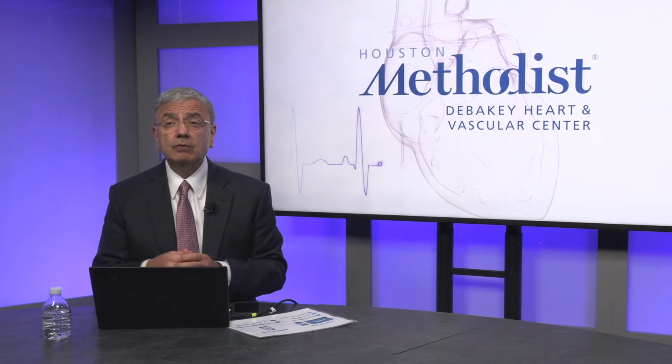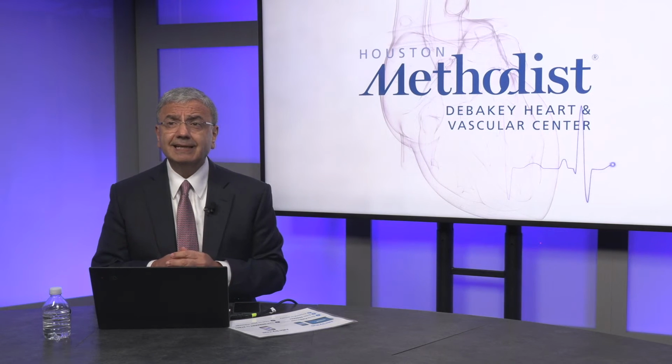At times, if we're talking about the signal itself, audio can tell you about its pitch and therefore the velocity. So just imagine if you hear the audio of a mitral, let's say, inflow or LV outflow tract versus a continuous wave Doppler of an aortic stenosis jet. If the velocity is so high, you can barely hear it, depending on how good your hearing is. So if this is the intent of that question, you can tell how high the velocity is and whether it's coming towards you or not by just listening to the audio, without looking at the spectral display at all.